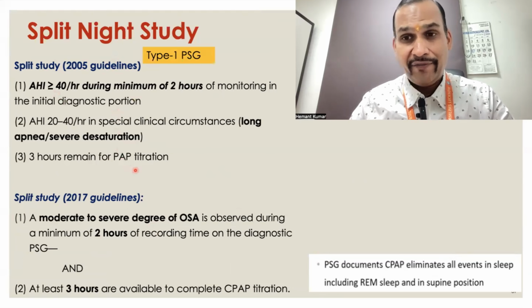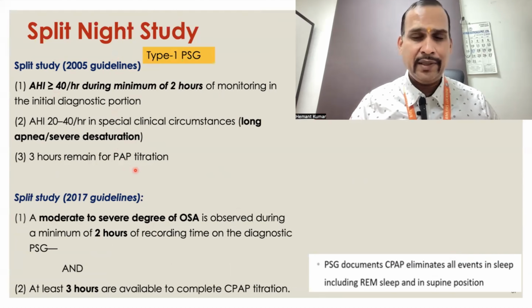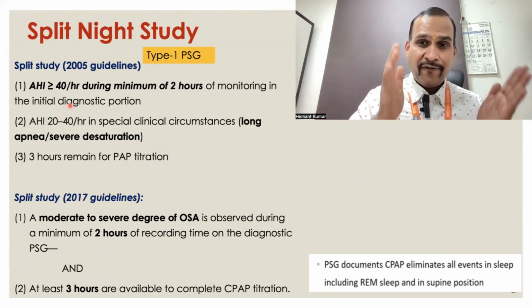We know that everyone is busy in their life. So if you advise somebody that you have to come two times, one for the study and one for titration, he may be absent. So in this study, what we can do is divide the night in two parts. In the first half we do the diagnostic study, and in the second half we do the titration study.